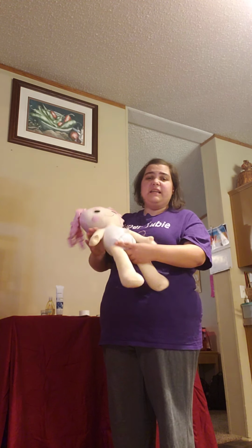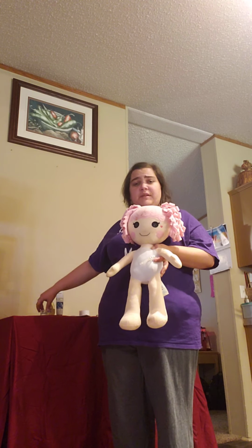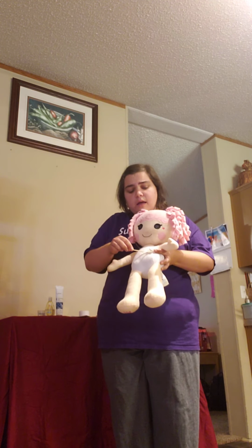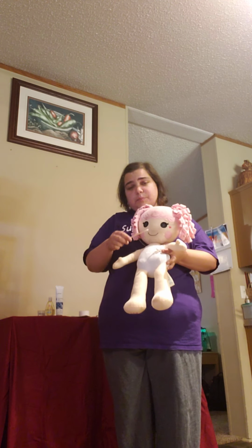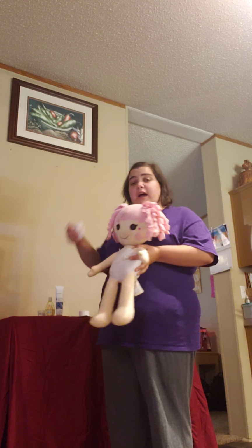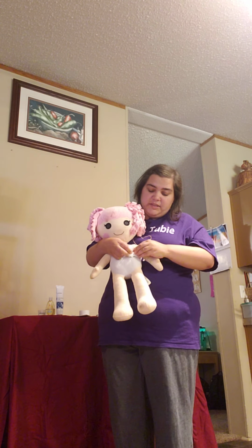A feeding tube should be cleaned daily and is probably one of the easiest tasks involved in caring for a feeding tube. The first thing you will want to do is have your soapy sterile water and Q-tips. You will clean around the button and make sure it's very clean. Once completed, you will dry off with either dry Q-tips or a tissue. Once dry, you will place your split sponge gauze around the button to protect the skin, and you will close it off with a piece of tape.